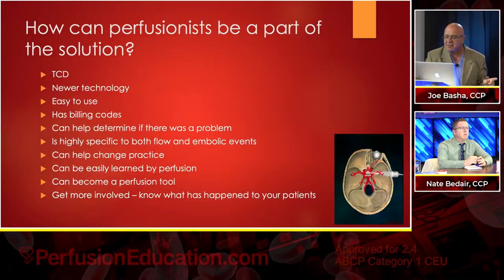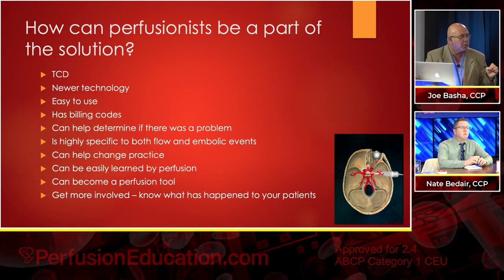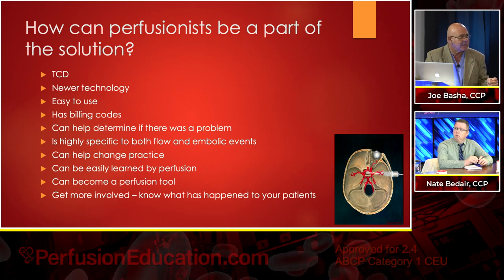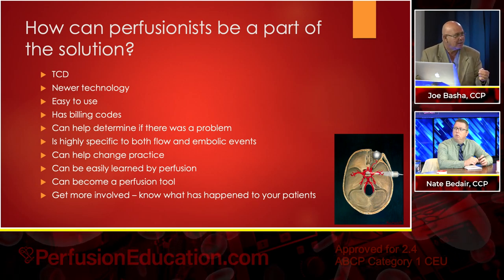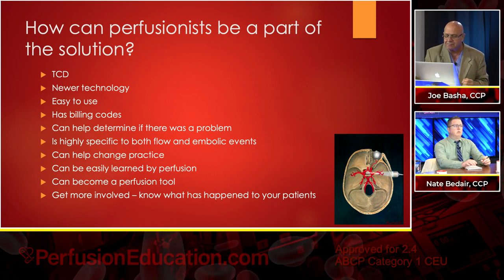Is highly specific to both flow and embolic events. So it will show you whether or not you have good flow through the middle cerebral artery. You can see it. If your cerebral perfusion pressure, if you don't have a good opening pressure and it's clamped down, it's not opening. Not getting flow. You don't have flow, you know it, okay?